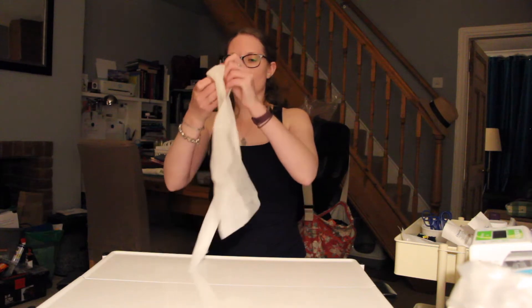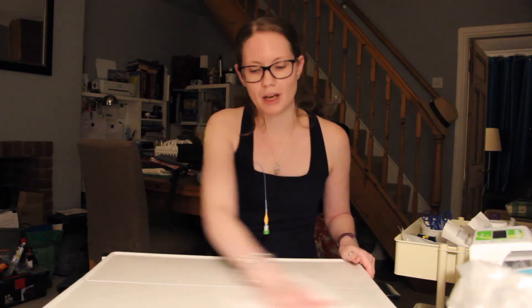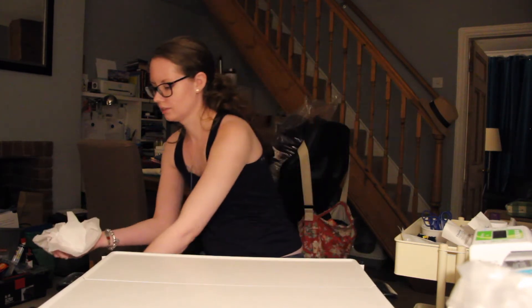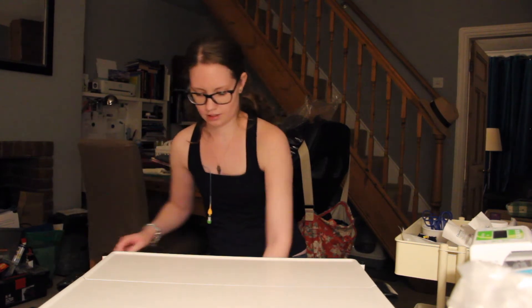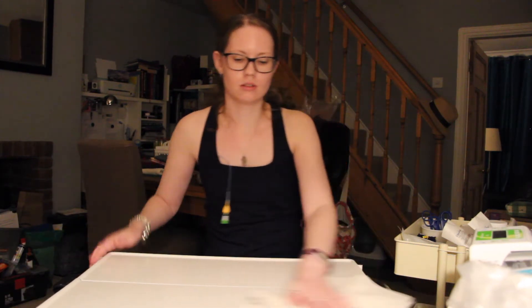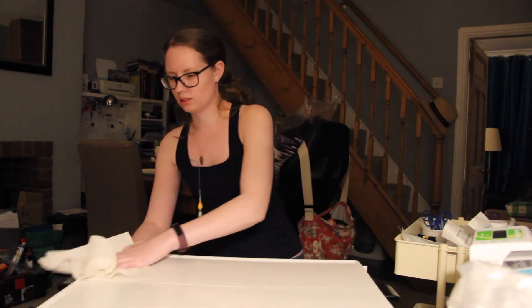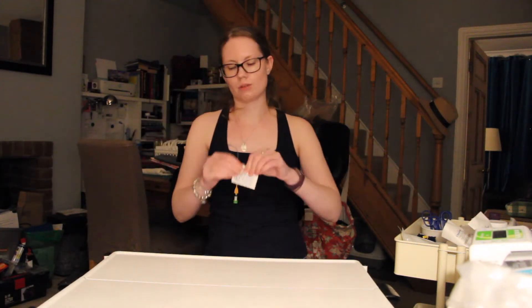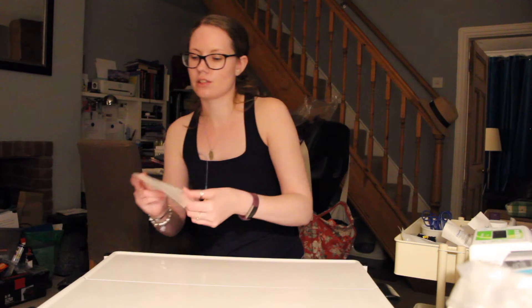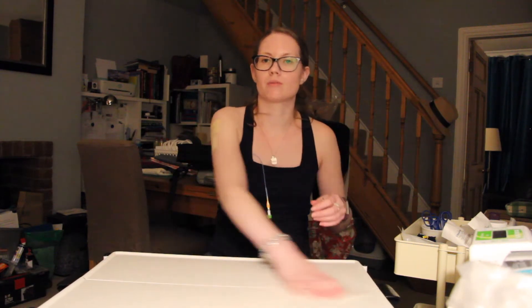I've washed my hands, obviously, and the first thing to do is to wipe down the trolley. I've got a few too many wipes out, but never mind, it's a new packet. I've just got a little bin bag down on the side, makes life a lot easier. So then you need to dry with disposable paper towels. And wipe the surface with a sanicloth, which is an alcohol chlorhexidine mix wipe — it just sanitises the surface. This one you need to air dry as it's the evaporation that breaks the cells of the bacteria and kills it.